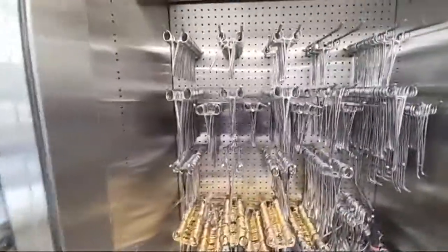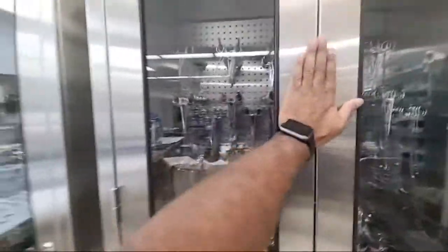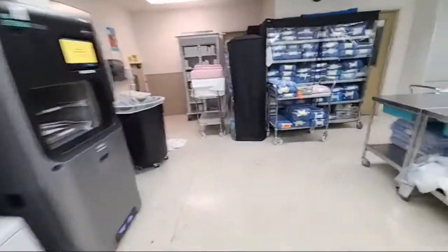These are the extra equipment. You can see there's lots of extra equipment. Very well stocked. A little bit messy on the bottom. There we go. Those are mostly clamps, hemostats, forceps, many names. Here are your scissors, blades, utility scissors, things like that. Any questions in the chat so far?